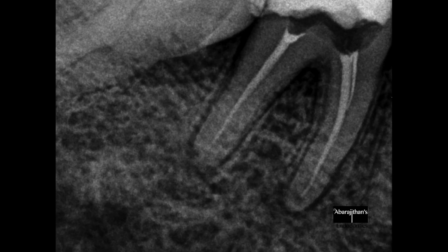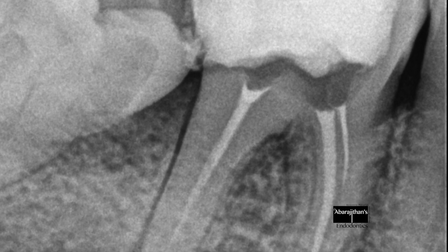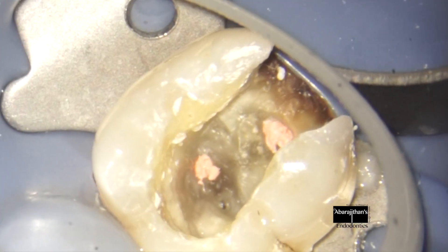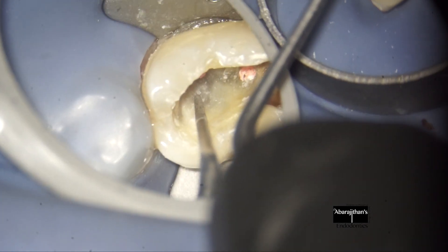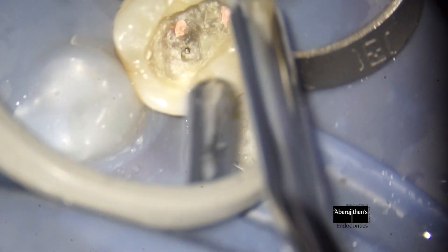Hello friends, sharing with you all a case of instrument retrieval. This patient was referred to me for the management of a separated instrument in the buccal canal of the mandibular molar. Though the instrument is in the coronal third on radiograph, clinically I was not able to visualize the instrument.